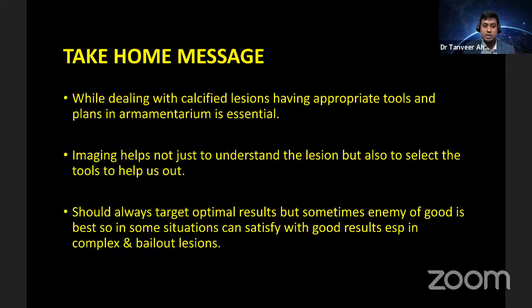So, some take-home messages which I think were important in my lesions. While dealing with a calcified lesion, we must have different tools to bail out in a crisis situation. Imaging does help, and we should never underestimate the importance of imaging pre and post lesion modification. We should always target optimal results, no doubt, but sometimes the enemy of good is best. In some situations, we should be satisfied with good results, especially in complex and bailout lesions.